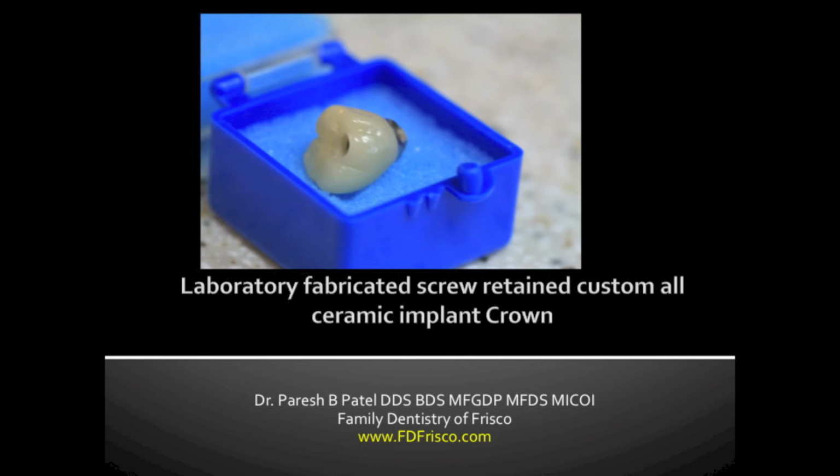And here you see the dental implant crown. It's a screw retained crown, and what I mean by that is there is no glue or cement needed to place this crown in the patient's mouth. We adjust the crown, we place it onto the dental implant, we torque it down, and then the little hole that you see in the biting surface of the crown is covered with a white filling material.